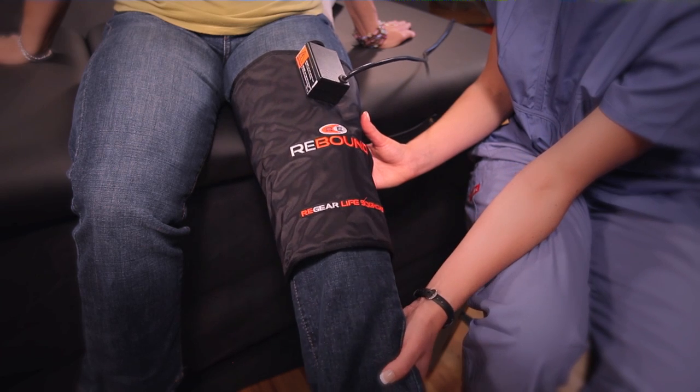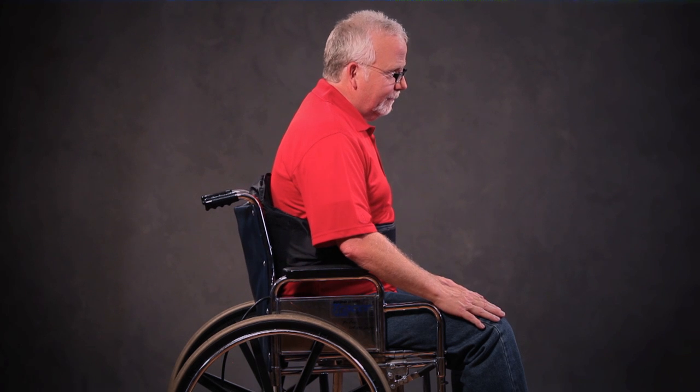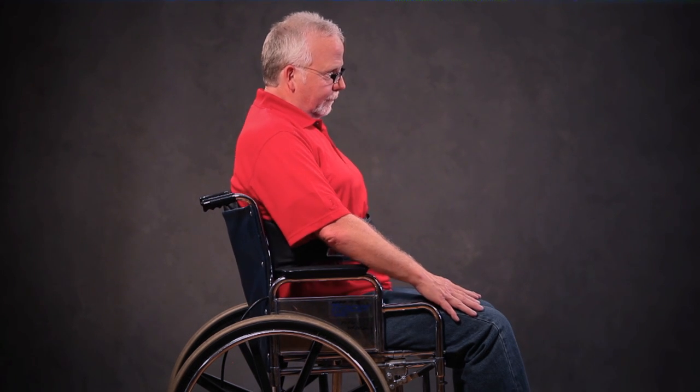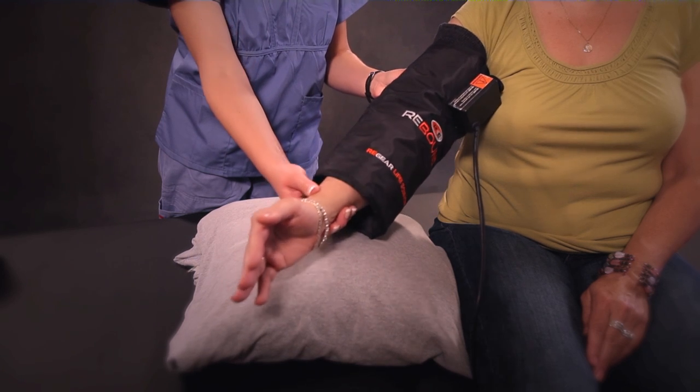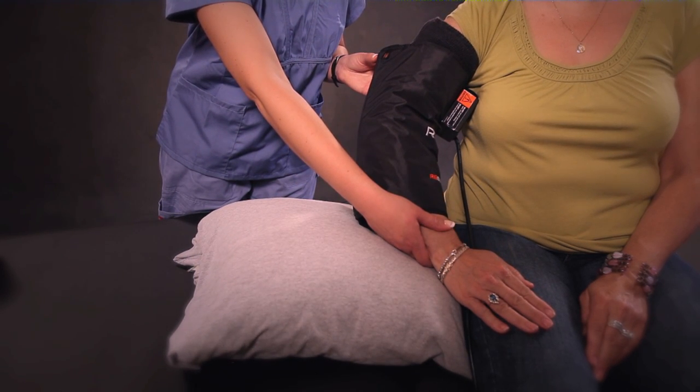If the patient adjusts their position, such as bending or straightening a limb, or changing the amount of pressure against the garment, such as leaning forward or leaning against the back garment. When the person changes position, the coils inside the garment are moved. This is ultimately what causes the field to change.